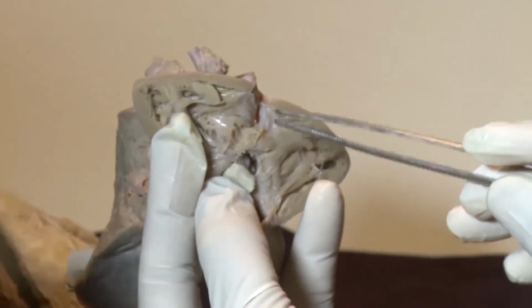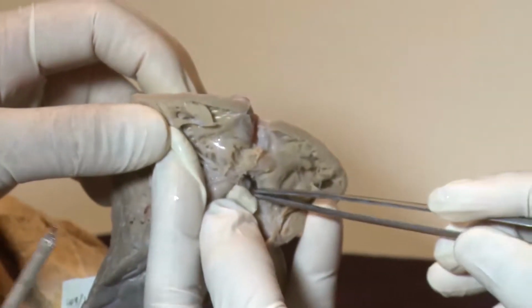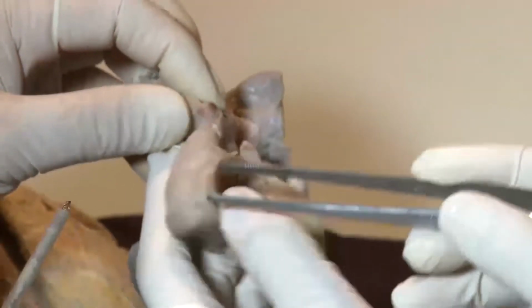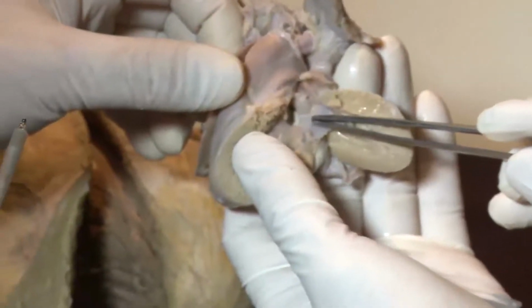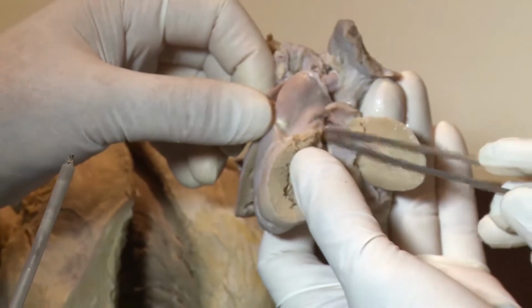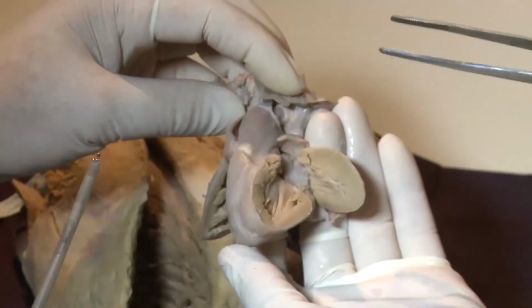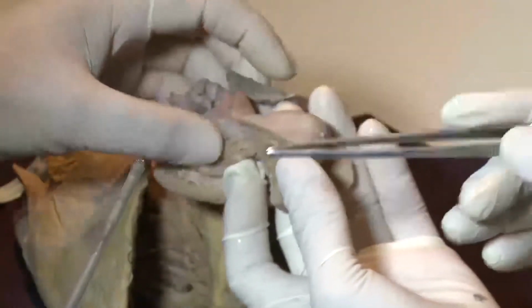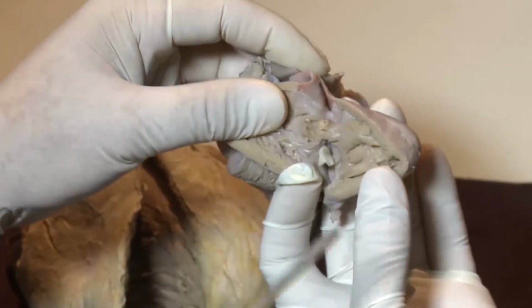So it is not that dangerous compared to suturing this margin. Also the pressure of the left ventricle is higher than the right ventricle, so the left ventricle pressure will push the disc to the right side, so it's appropriate to use this kind of ductal occluding device.